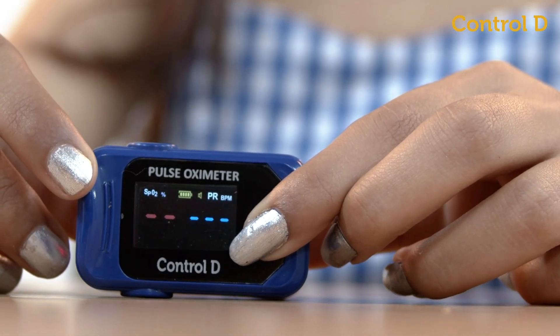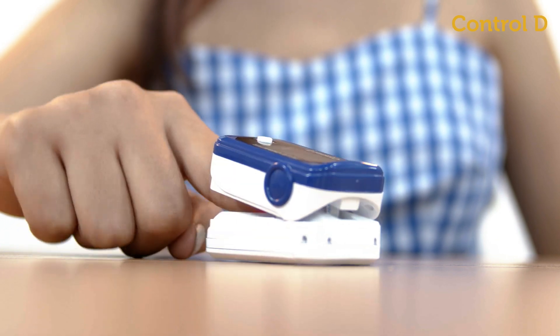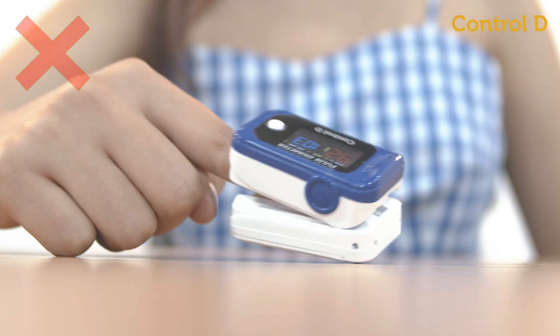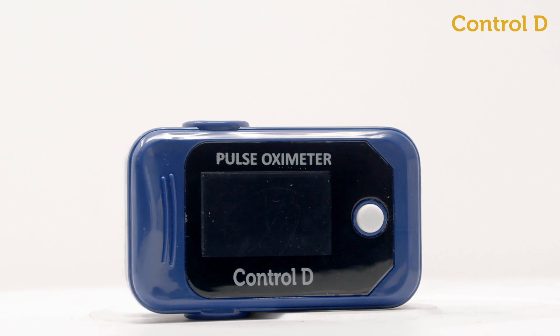Do a long press to enable or disable Bluetooth. Do not move or tilt your hand while using the pulse oximeter. Take care of your health anytime, anywhere with the Control D pulse oximeter.